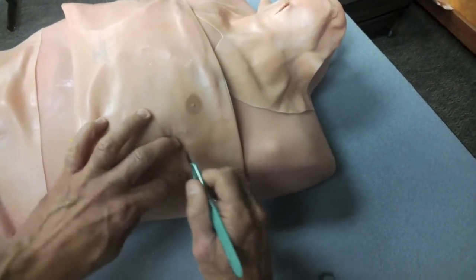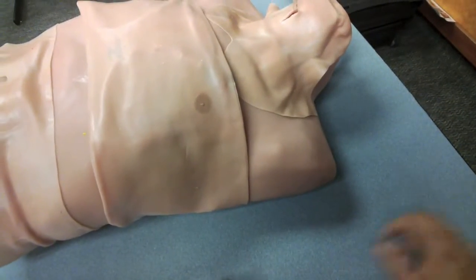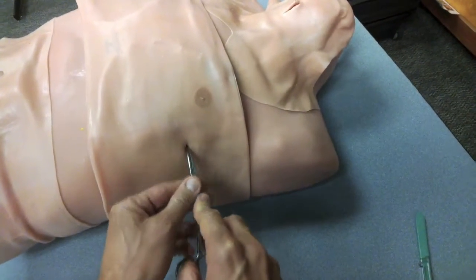Once you find the space, you want to make an incision, and after you make an incision, you want to dissect.